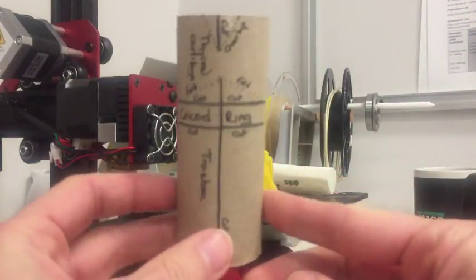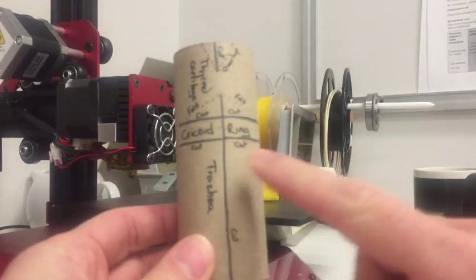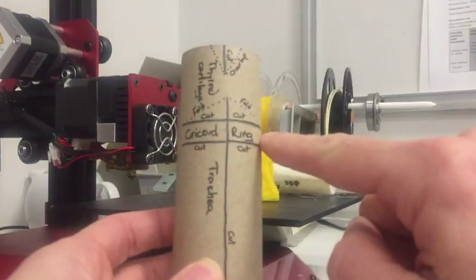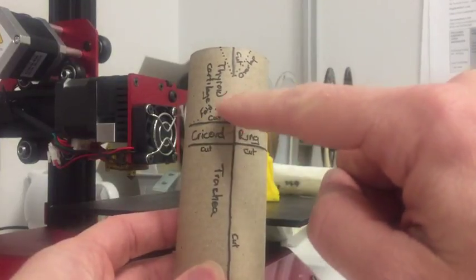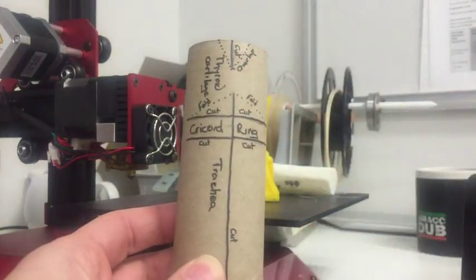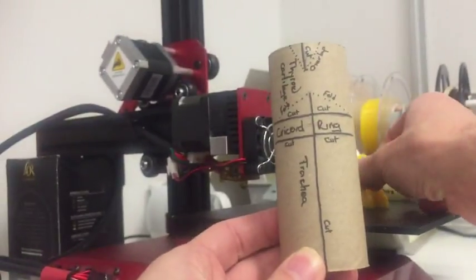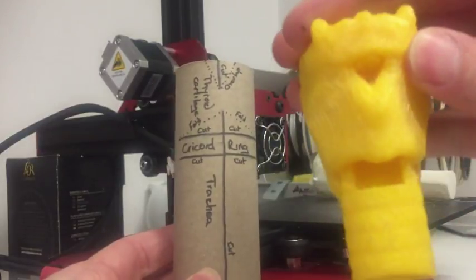Basically, this is the map that we're going to use. So this portion down here will end up being the trachea. This ring in the middle will end up being the cricoid ring, and we're going to do a little bit of cutting and origami to make the thyroid cartilage. But it should turn out to be a laryngeal cage that's not far off looking like this. Right, let's have a crack.